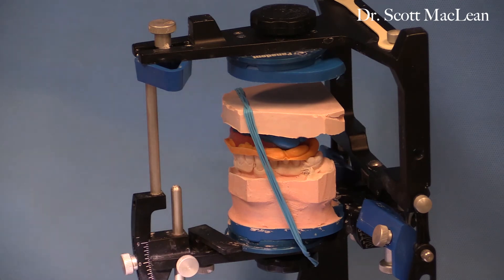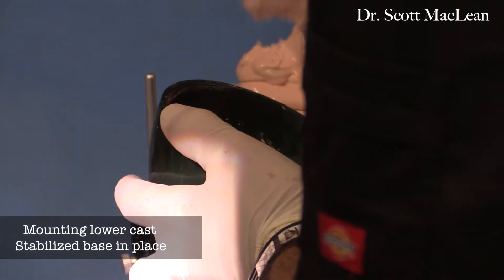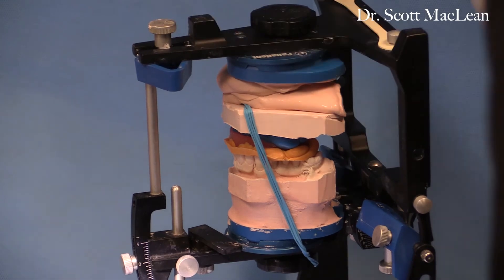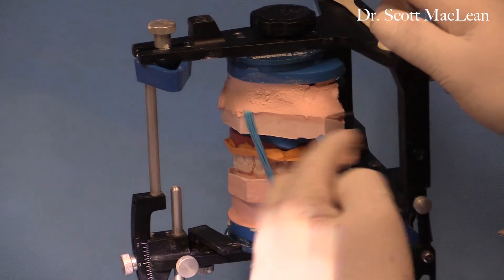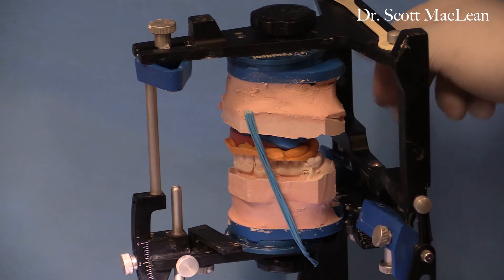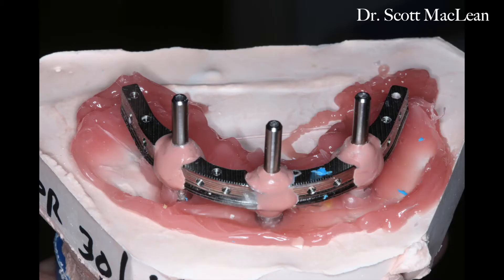Once we mount this on the articulator, we have a face bow mounting plus the bar mounting with the stabilized base. This gives the technician the ability to make the rest of the bridge by taking the bar, adding teeth to it, doing a wax up, and seeing everything they need to do. We verify the records and confirm the occlusion is good, so that when we go to put the final bridge in it will take a lot less time because we have all the records we need.